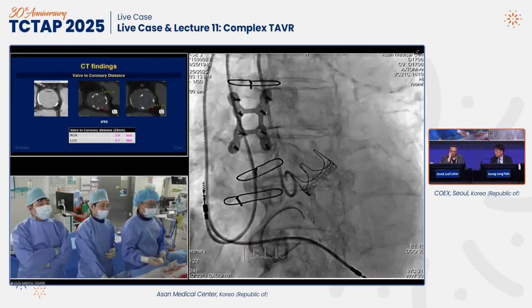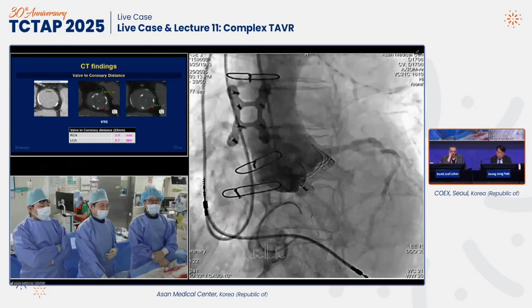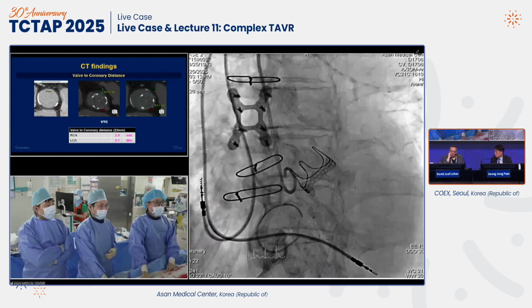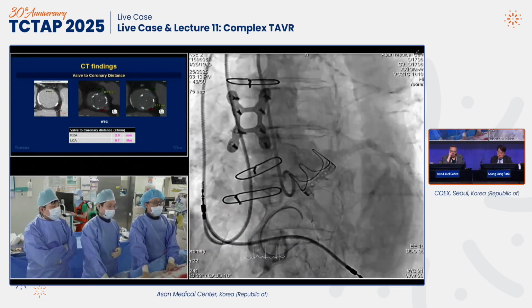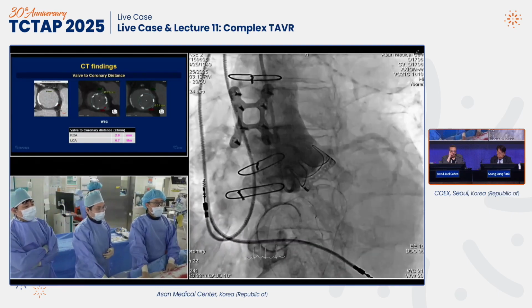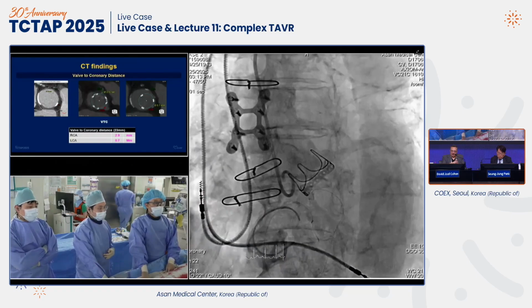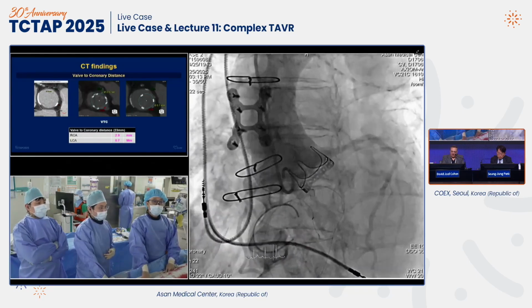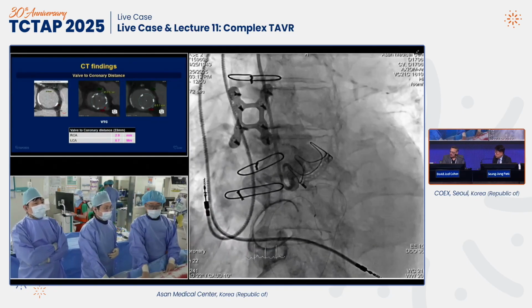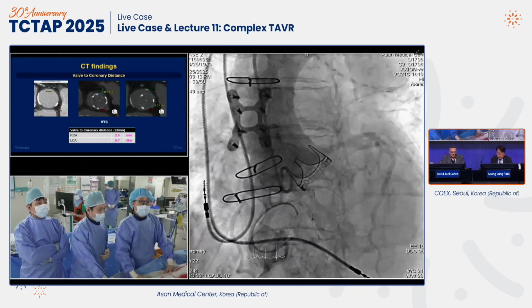So the one thing I wouldn't do here, DW, is fracture the valve. If you were thinking about that, you and I have had plenty of experience with that. But what I would be thinking of is a basilica. I would absolutely be thinking very hard about doing a basilica here with that low of a coronary, very little distance to the coronary. A basilica in a surgical valve is one of the better basilicas you can do. Have you been doing them now? I didn't know if you had started to do them yet.